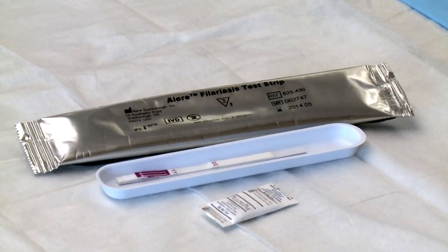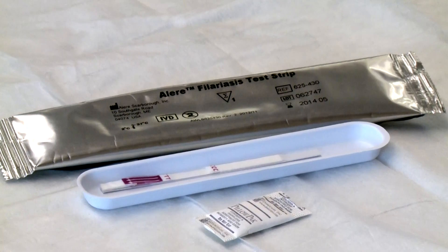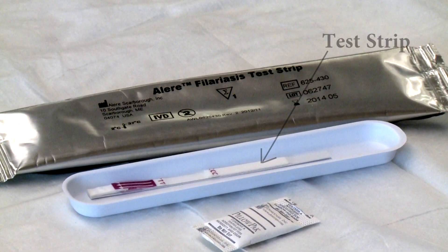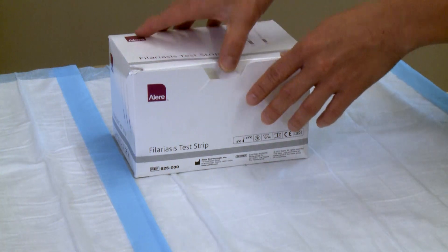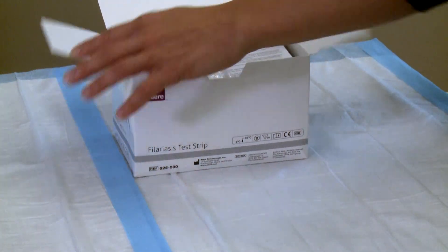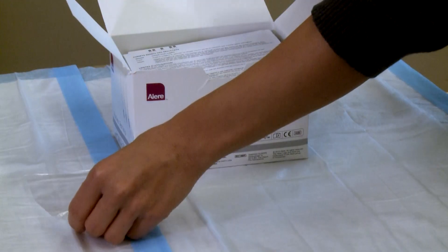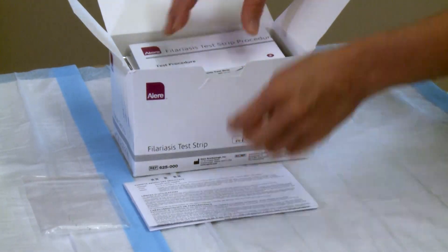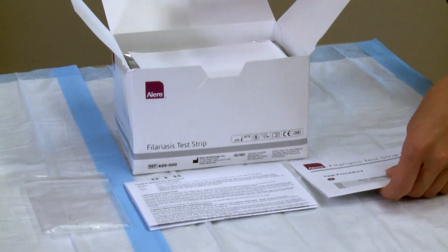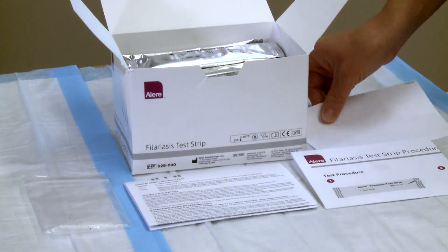Each FTS kit comes sealed in an individual foil pouch that contains one test strip, one plastic work tray, and a desiccant packet. The box of 30 kits also contains 32 calibrated micropipettes, a product insert, a procedure card, and adhesive sticker type labels.